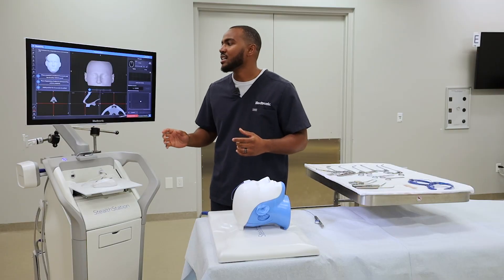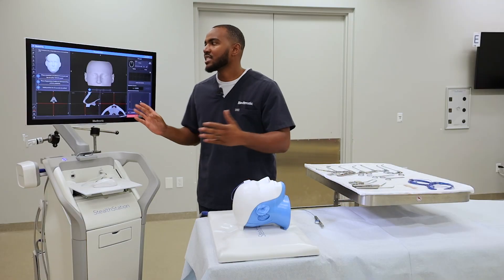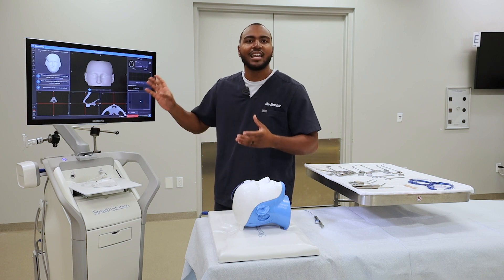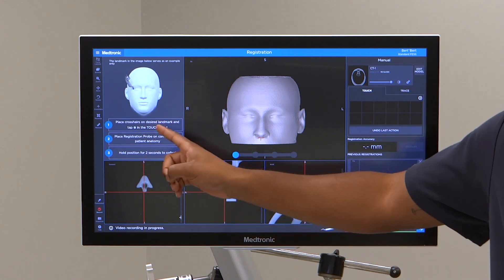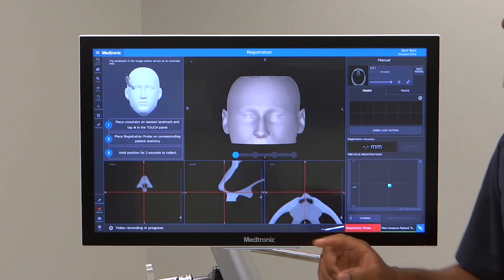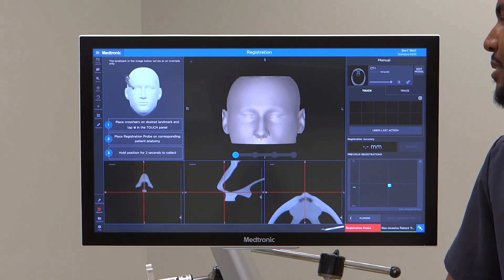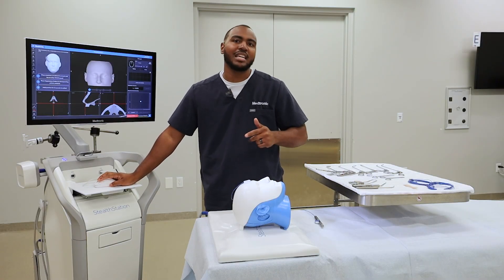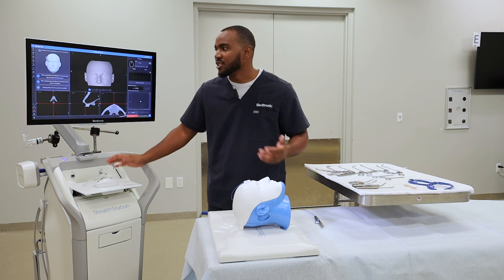Touch registration combines four registration points. Just like how the additional touch point works with trace registration, if you wanted to add an additional touch point, it prompts you on the step. You'll first place crosshairs on the desired landmarks and tap the plus sign. Great points to use are columella, bridge of nose, inner and outer canthus. So I'll do columella and inner and outer canthus for this video.